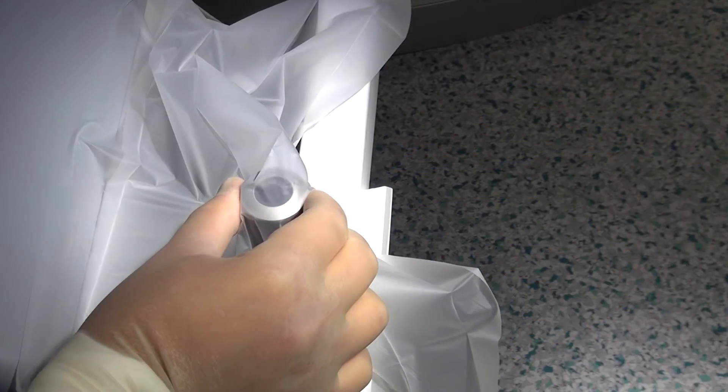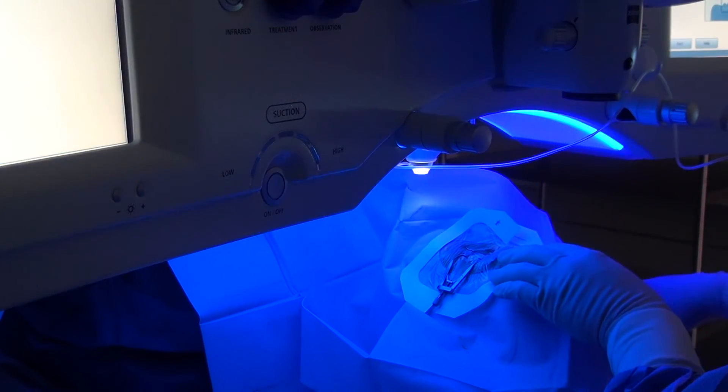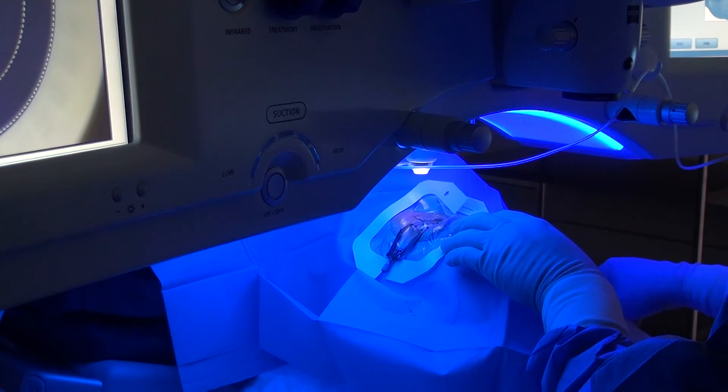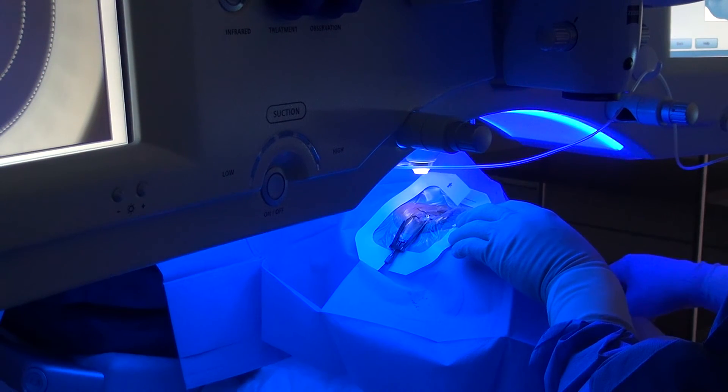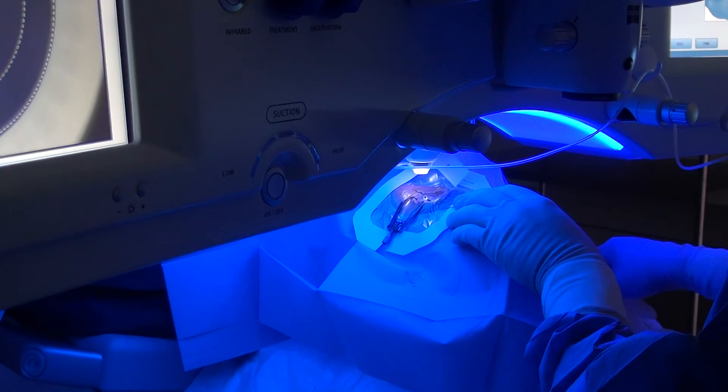Bring the patient's eye into the treatment position by moving the supporting system. This is done by using the joystick. You want to repeatedly check the position of the head and the eye when the cornea is approaching the contact glass. Also, check the position of the eye in the operating microscope on the left-hand side monitor.